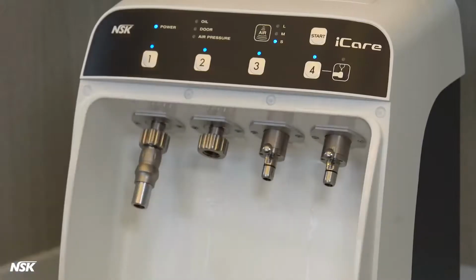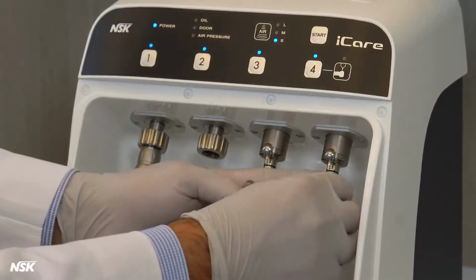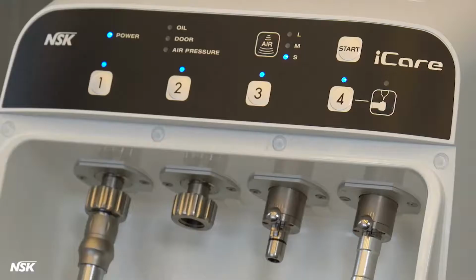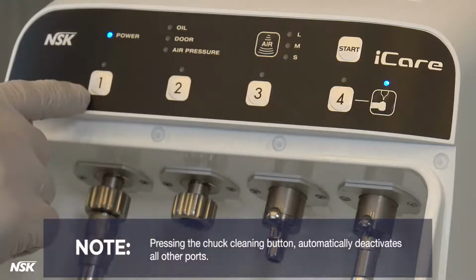With the iCare door open, insert the chuck cleaning nozzle into the port number 4 until it locks in with a click. Press the chuck cleaning button. Note, this automatically deactivates all other ports.